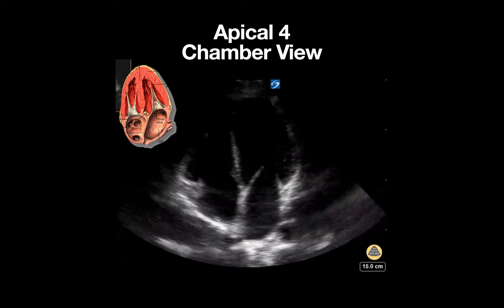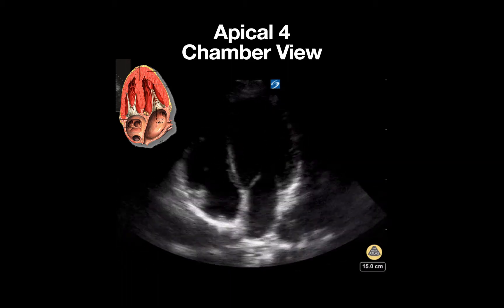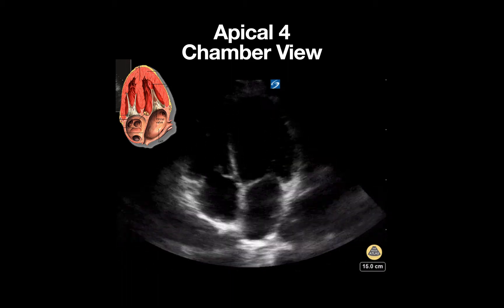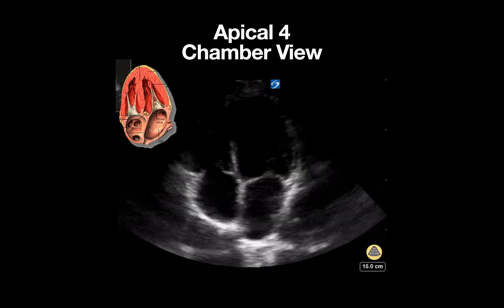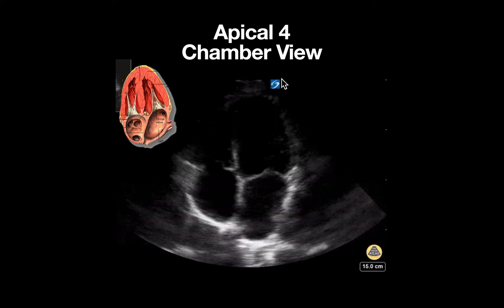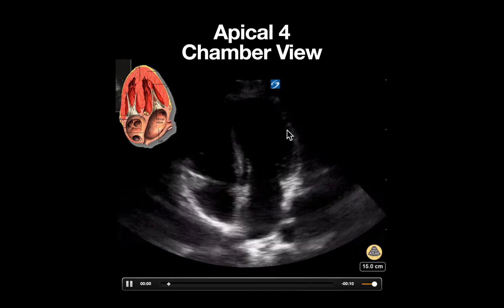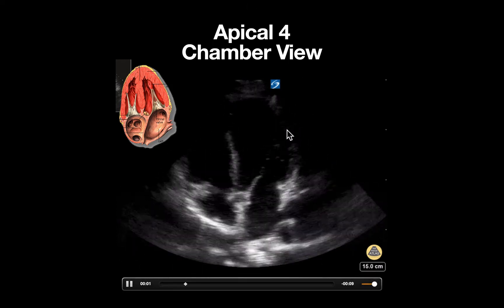This is an ultrasound clip demonstrating a normal apical four chamber view. Notice that the probe marker is on the right side of the screen, which is normal traditional cardiology orientation.